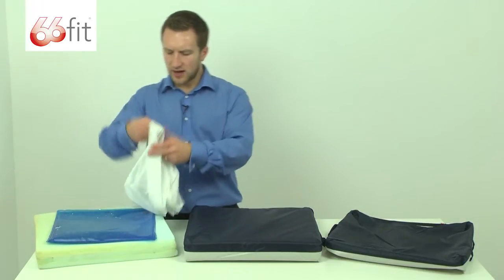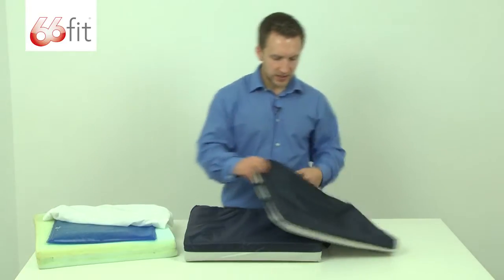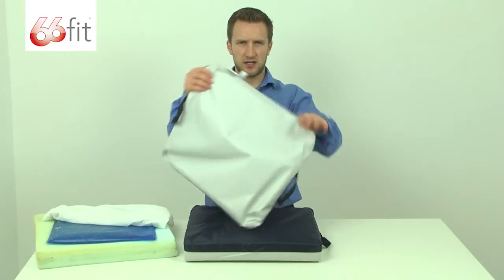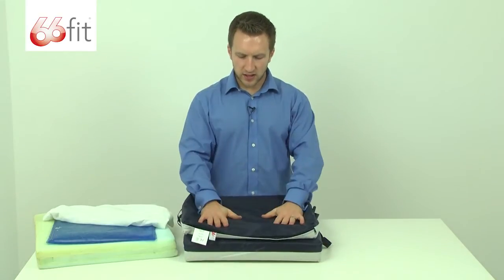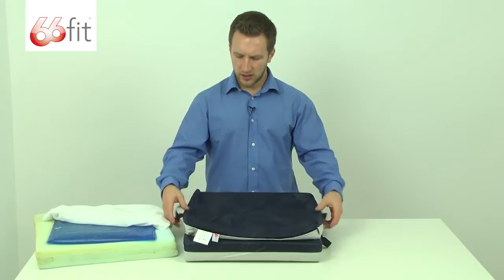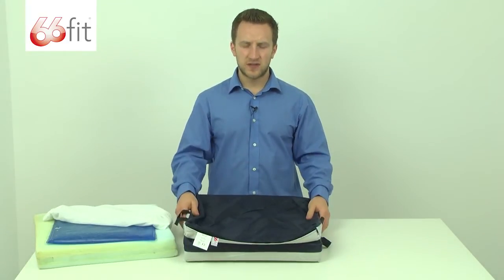On the outside of that, you've got this white cover, and then that itself sits inside this blue outer cover. It's blue on this side and white on this side. This is the side that you would have up, so you're going to sit on this side with the white side down. You can see there are extra handles on the side here, that's just because the cushion itself is a little bit heavier.